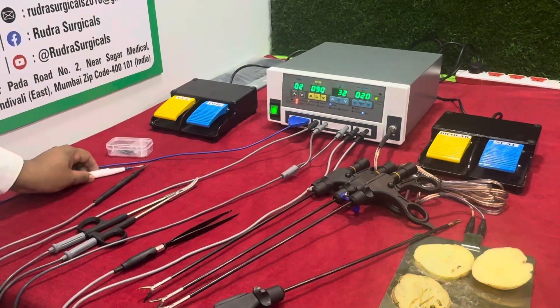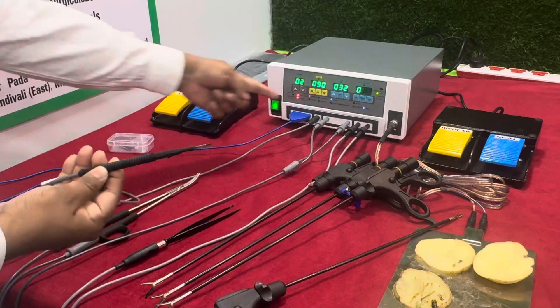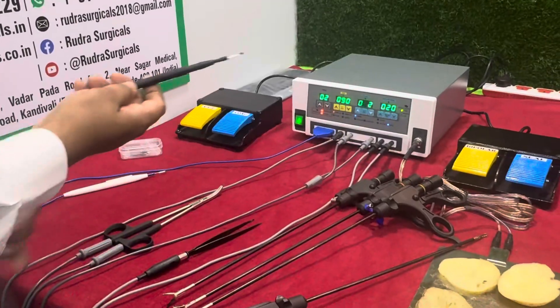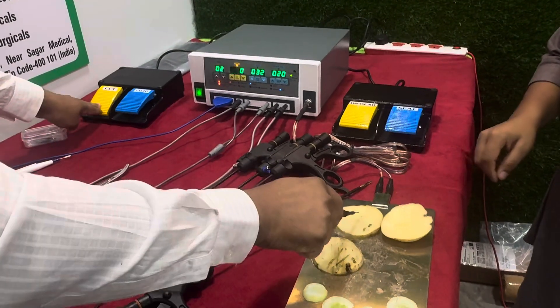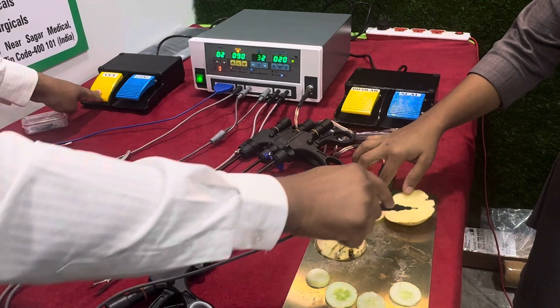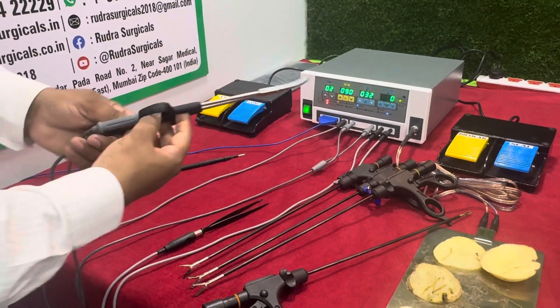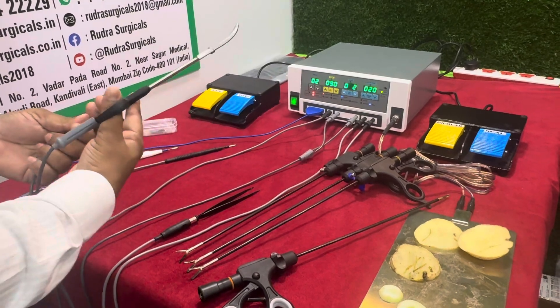This is a double pedal foot switch monopolar used for cutting and coagulation. This works only using feet. This is a vessel sealer with bipolar cable. This bipolar is used for seal purpose.